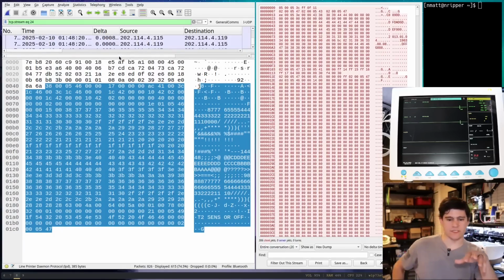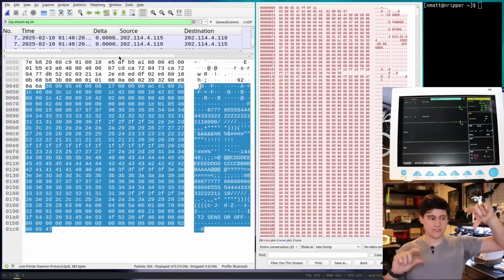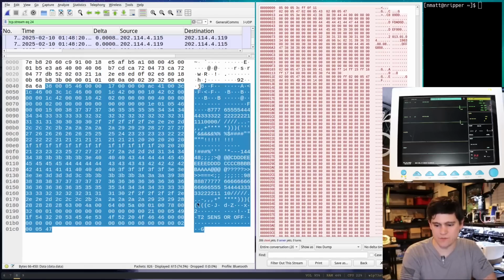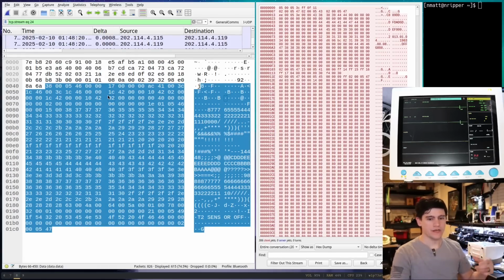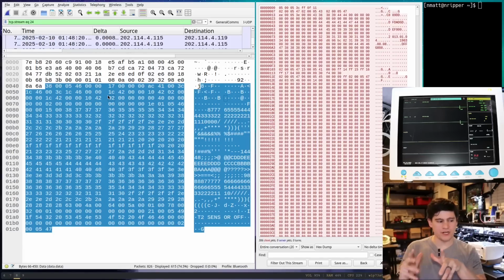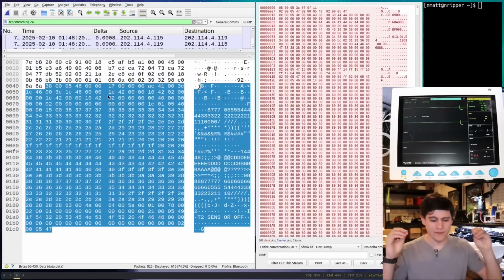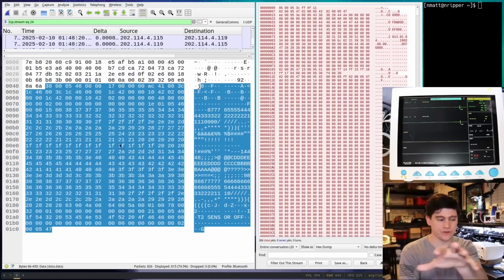So here we can see a bit of this data packet. And what we're going to do is look through here for that value. We can do this in Wireshark, but I'm actually going to start to develop a Python script, and we're going to walk through this together. This was my process that took way longer than this video is going to be. We're going to look through all this data and try to find the needle in the haystack here.